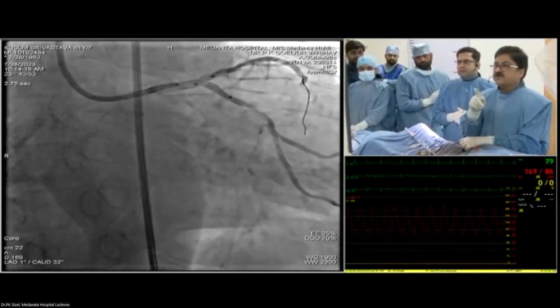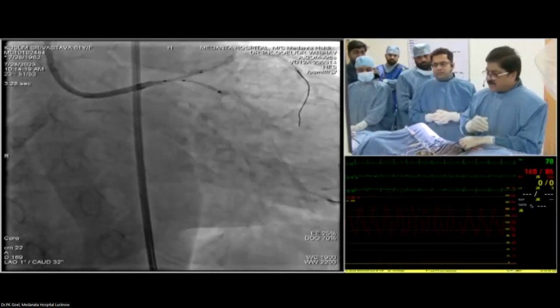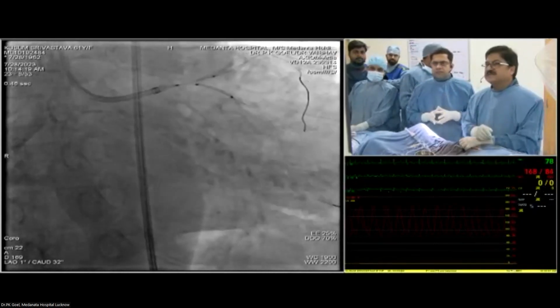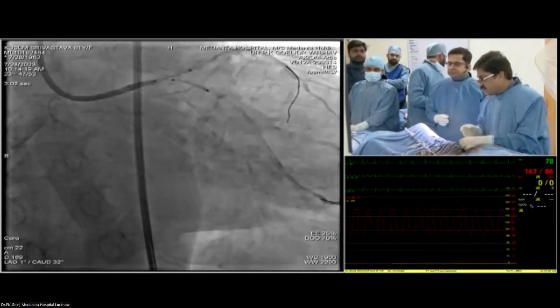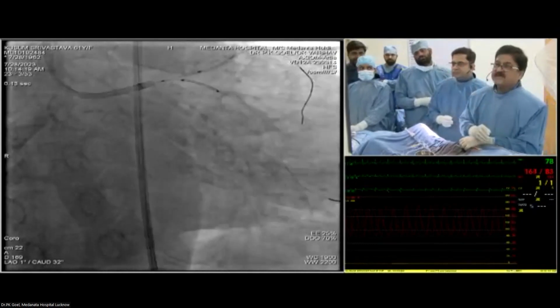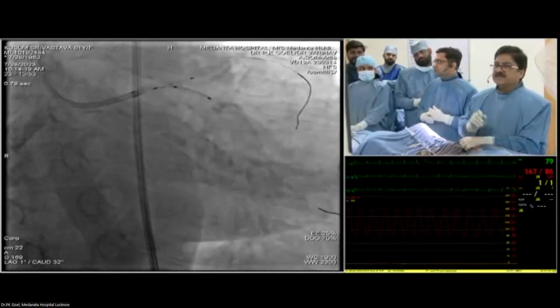So what I'm trying to do, in the majority of these cases, I do not have big areas overlapping inside the left main. Now this angle is about 60 degrees, I would say. You would agree, this is about 60 degrees. If it were 65, 70, this would be the best strategy. I'll just keep it more like a T stent. So anyhow, it is a little into the left main and I have done the stent. Go ahead.